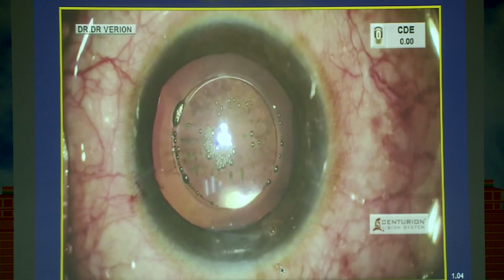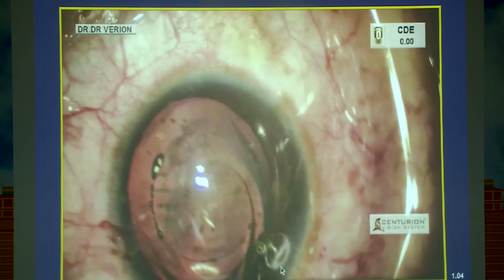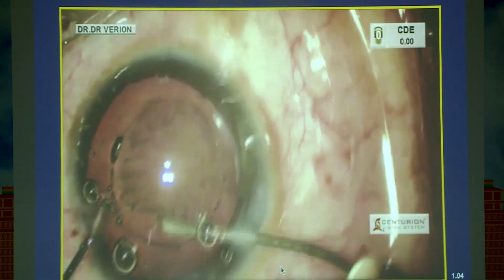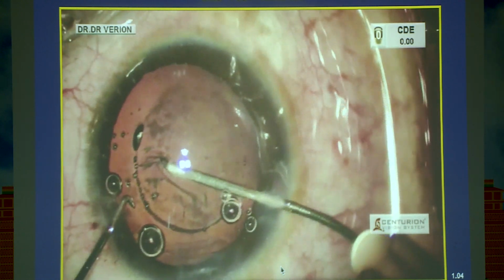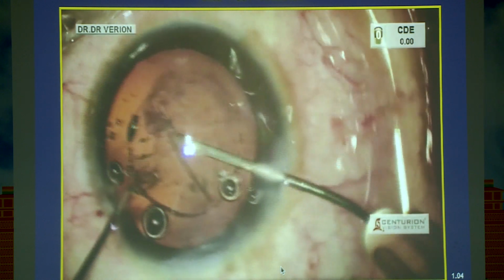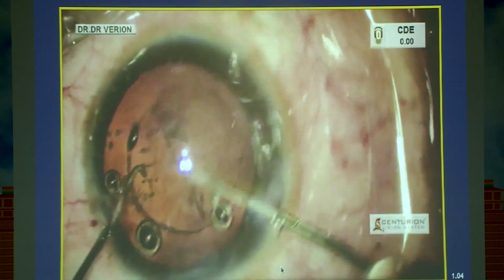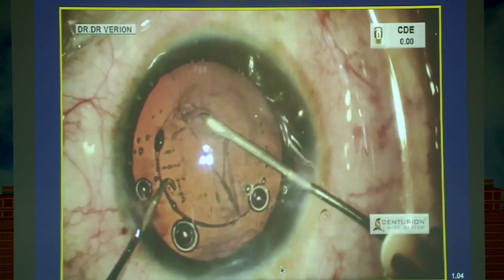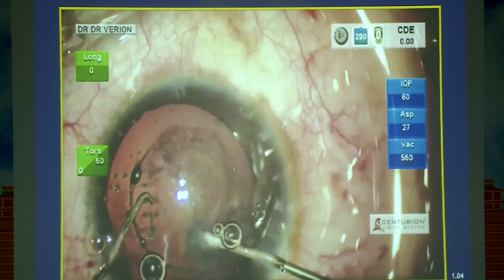This is essentially to show that the laser can go through the material of the lens and create an adequate rhexis. It's not a free floating rhexis that you get, but a nice template of the rhexis, and essentially you can go ahead and then, in the conventional manner, create a rhexis of about 5.5 millimeters, and then implant usually a highly myopic lens that goes into the bag, giving you a fairly good outcome.